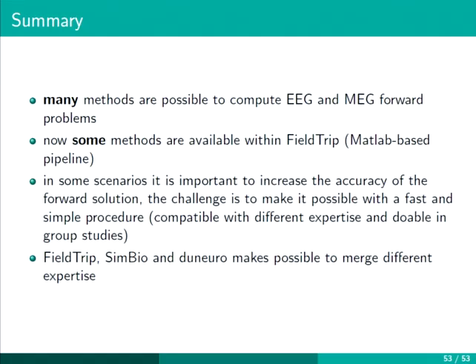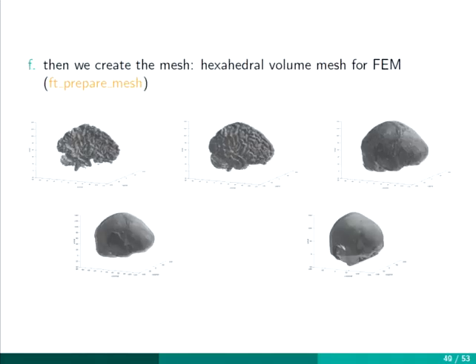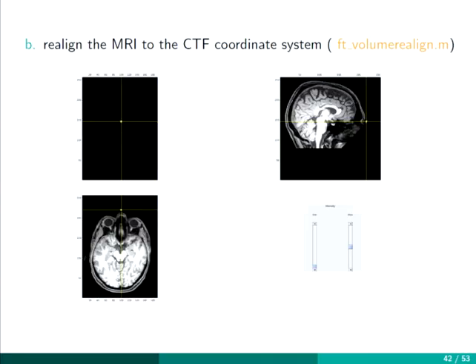But you should also do the MRI scan with markers, marked with vitamin E. Yeah, that's what you saw in the picture. Can you go back to the slides? Yeah, they were not random points. They were like these, these points here. These are like vitamin E or this is kind of gadolinium, something visible in the MRI. Yeah, and for the nasion as well. So this point is not part of our.